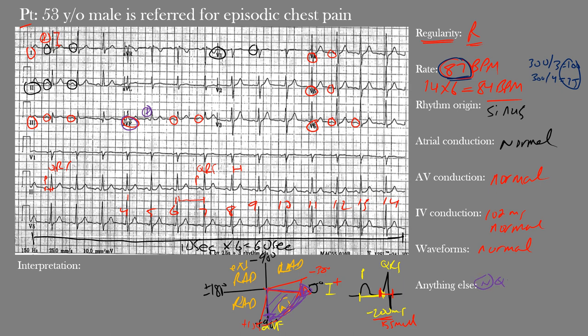We also have normal R wave progression in the precordial leads. R wave progression means the R wave amplitude should increase as we move from V1 through V6, because the left ventricle has the greatest mass and electrical mean axis heading in that direction. The R wave slowly increases in amplitude up until V5 — that is normal R wave progression.